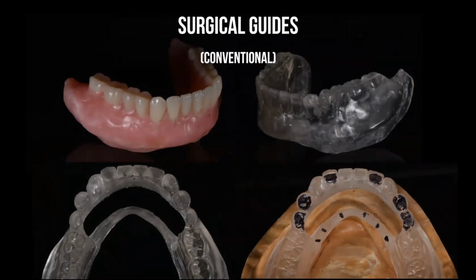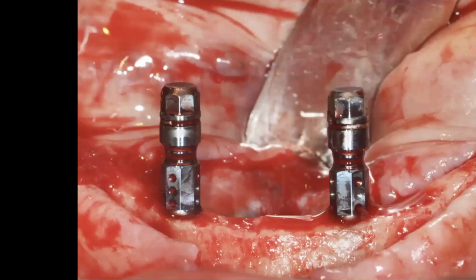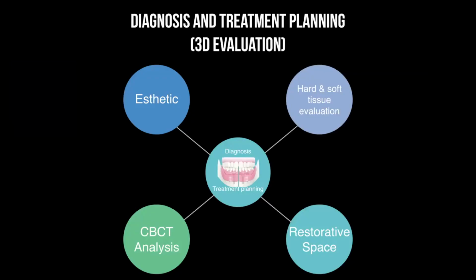And as you see in the lower right pictures, I mark those areas with Sharpies. Those are the proposed areas where I ask my surgeon to place the implants, within the confinements of my denture, but in the locations of laterals or premolars. In the canines, we didn't have enough amount of bone. And you can use it like that, and you can see in this case some bone leveling was done.